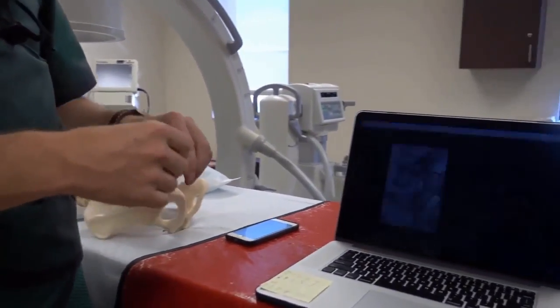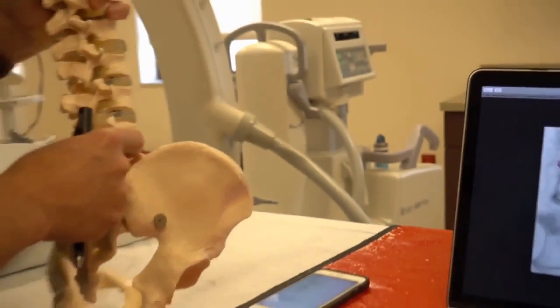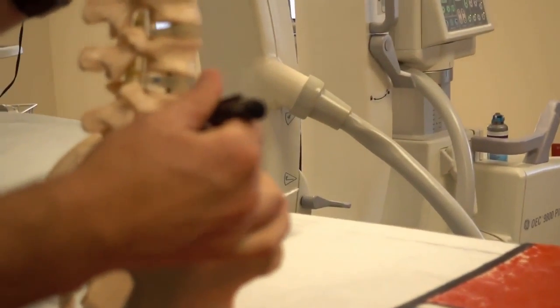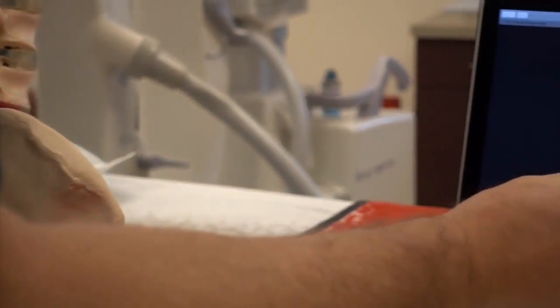So most of these things come from a projection like this. And this is, again, the Scotty dog view. You can see the nerve will come right underneath the pedicle, okay? And what's happening is you can see in this projection right over here, the pedicle is this connector. This thing right here is called the pedicle. It is the bone which connects the facet joint and the lamina to the vertebral body. It projects as a ring or a hole.